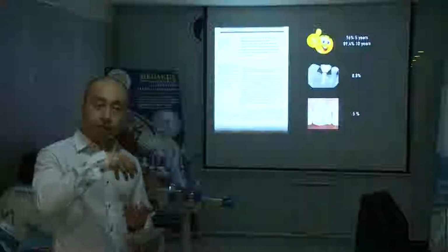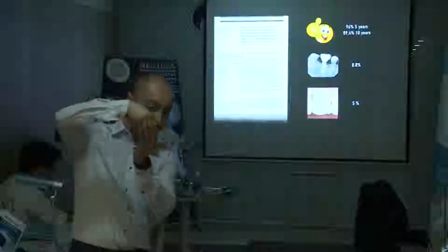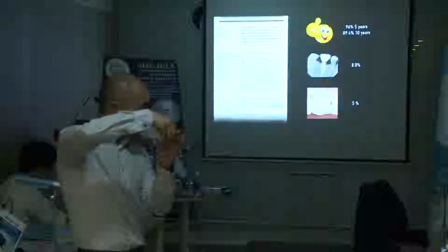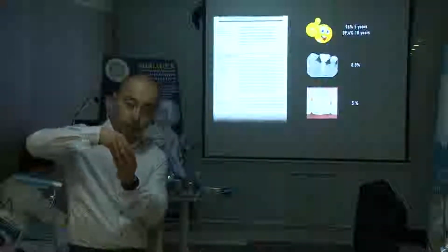It's because the abutment has a 5-degree connection in the implant. So when the abutment is in the implant, they're fixed already together. So even when the screw loosens, they will still be fixed. But because they're fixed, the screw will not loosen.